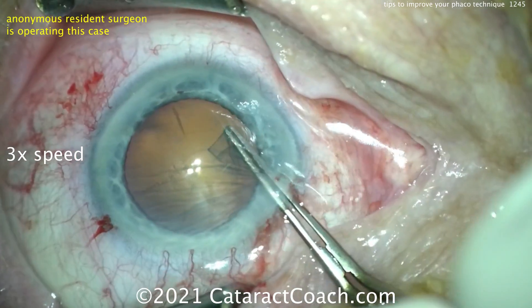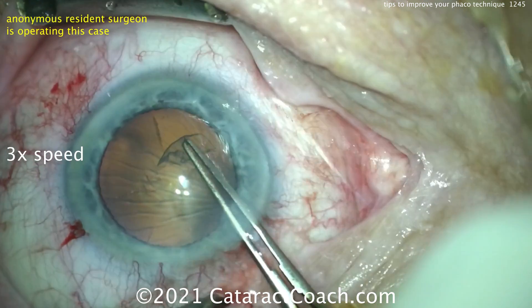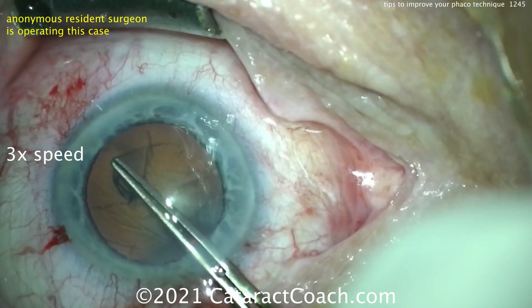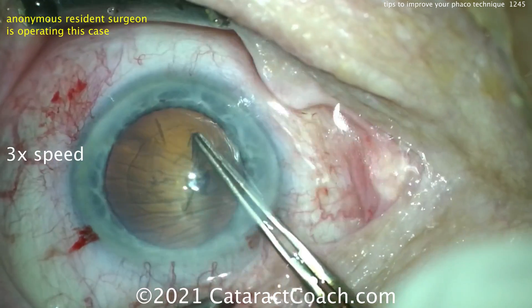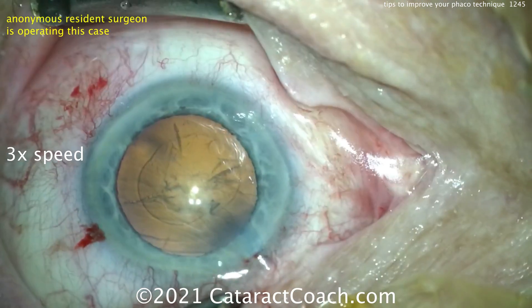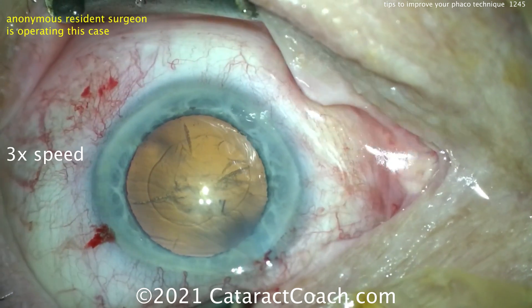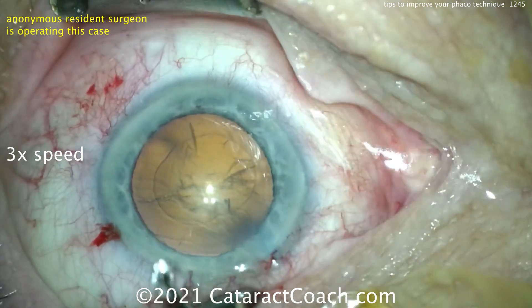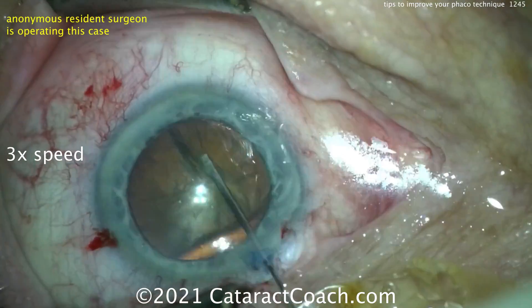See that — hitting the side of the incision; that's my title slide picture. You want to float in the incision so you don't cause those wrinkles — any wrinkles you cause in the cornea you're going to see tomorrow. Now that's a baby rhexis; it's going to be a challenge. It is continuous, I'll give you that, and it's pretty circular, but that's a baby rhexis and this is going to be a lot harder.